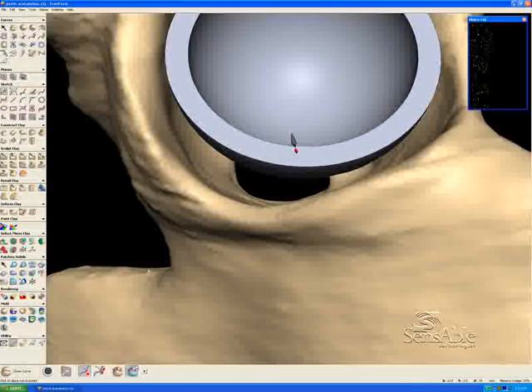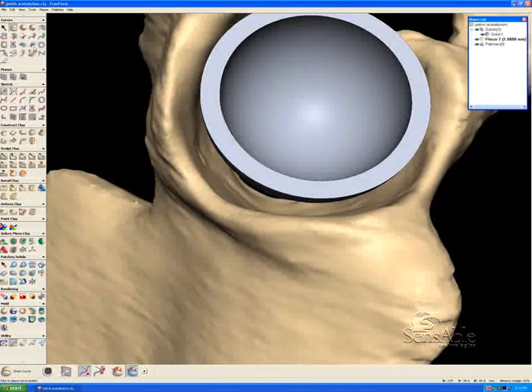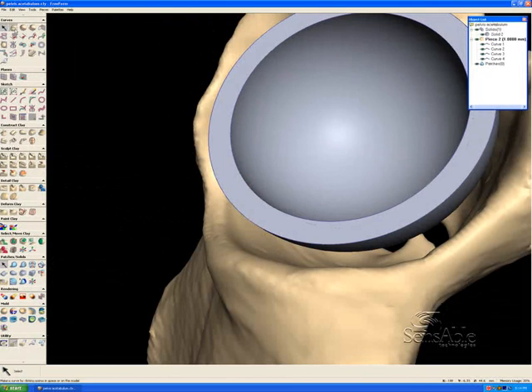What I want to do is draw a couple lines, a couple curves that are going to span this distance between this edge and this edge. But before I do that, actually, I think what I need to do is extract curves off of these edges. So I'm going to take the Extract from Edge tool and just select 1, 2, 3, 4, and I'm going to go back to our pen drawing tool.